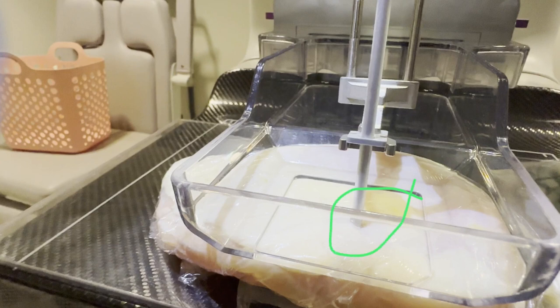At this point, you just want to take a look and see if your biopsy chamber is below the skin surface. If it isn't, you can wind it in a little bit, and I'm also going to show you a trick in the next few slides of how we can use a skin hook to help us.